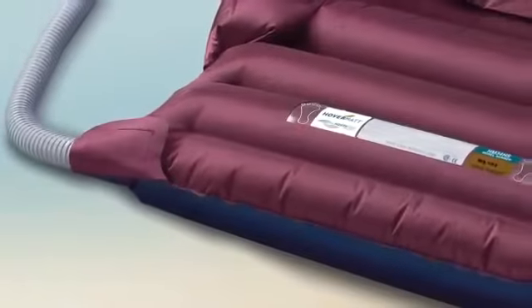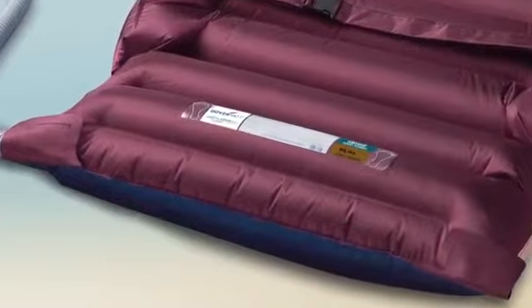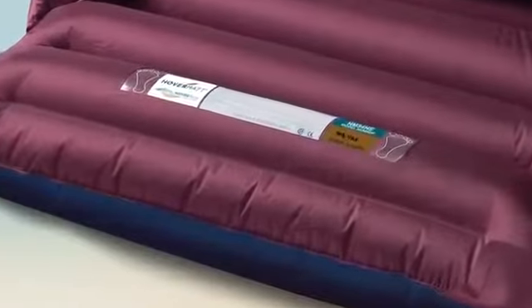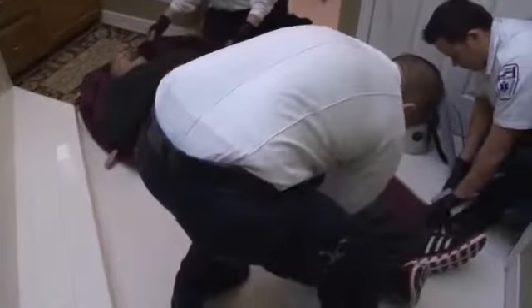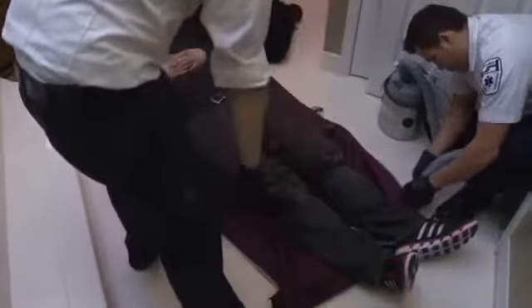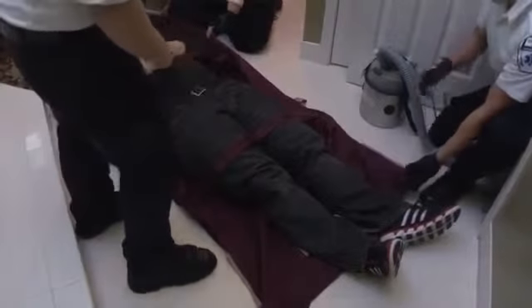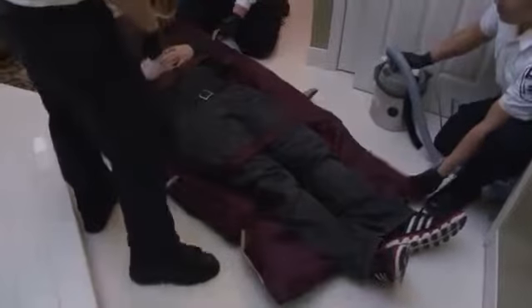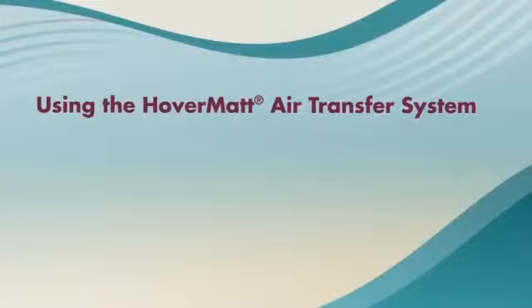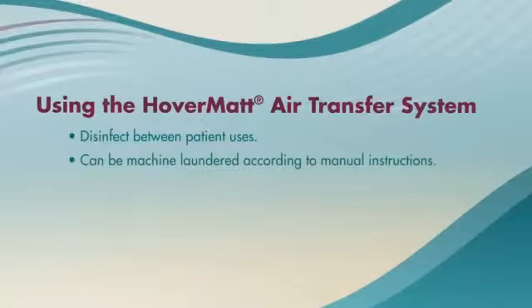The HoverMatt has 2 hose entries, one on either side of the foot end of the mattress. The label on the HoverMatt indicates the foot end and top side of the mattress. To operate the HoverMatt and Evacuation HoverJack 2 with HoverTech's original air supply models, Air 200G or Air 400G, press the gray button to initiate airflow. Press the button again to stop airflow. Both the reusable HoverMatt transfer mattress and air supply should be disinfected between patient uses. The reusable transfer mattress can also be machine laundered according to manual instructions.